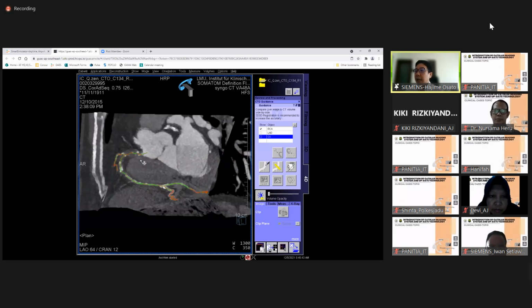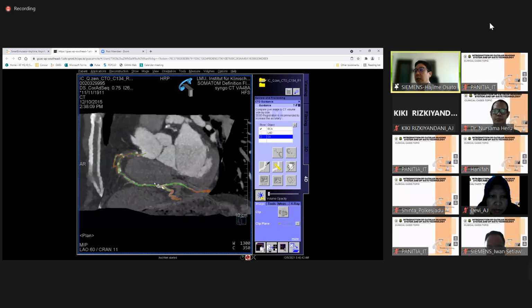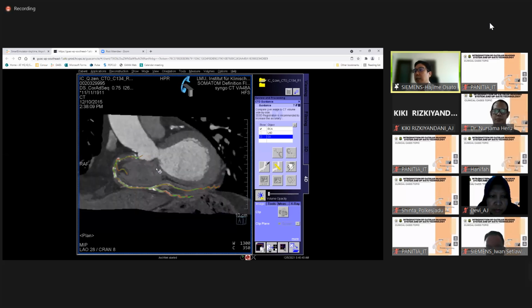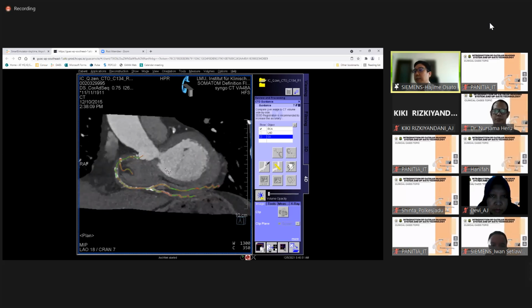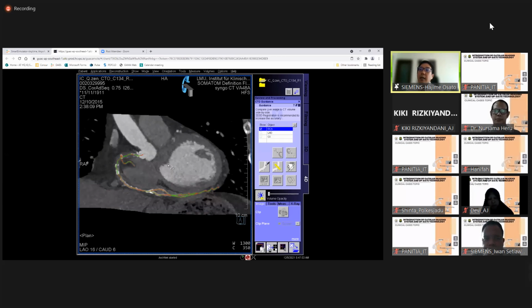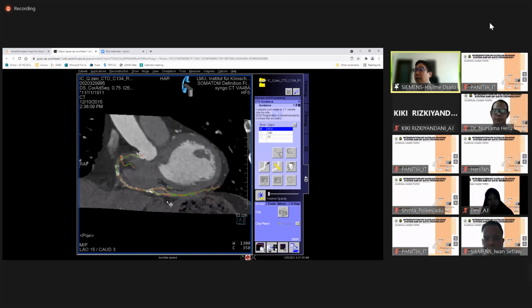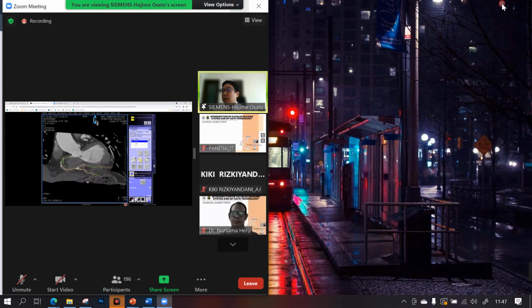After engaging the catheter, we change the angulation like this. We get this green angulation in the proximal side, but in the middle part we face a red color. So change the angulation and also look for the green line on the image.